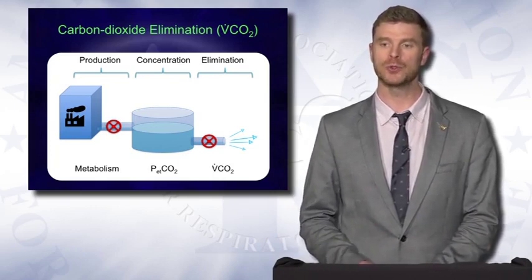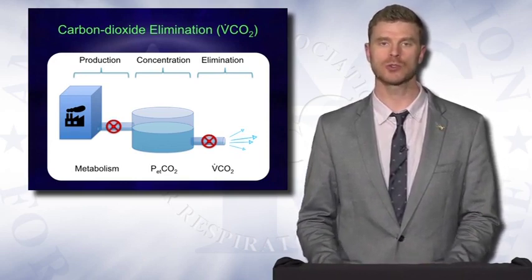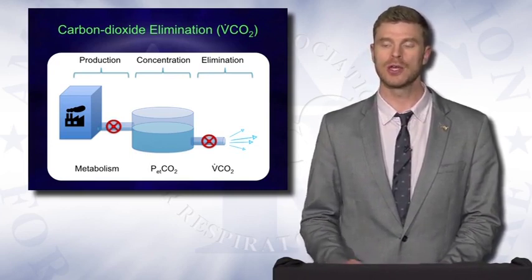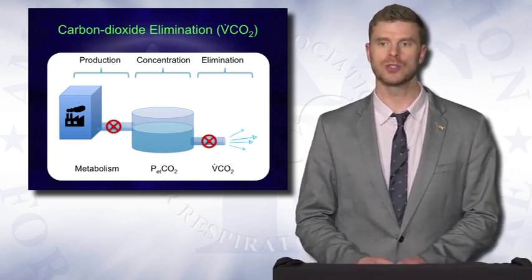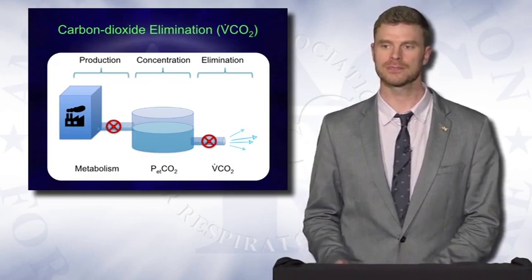However, if you do have a good period where you don't really notice too many discrepancies or increases or decreases in CO2 elimination, there are some statistical methods that you can do to ensure that your measure of CO2 elimination is closest, or probably closest, to the CO2 production, which is really what we're trying to measure in many cases.